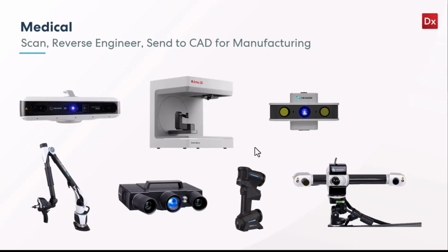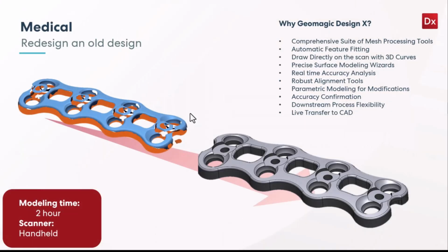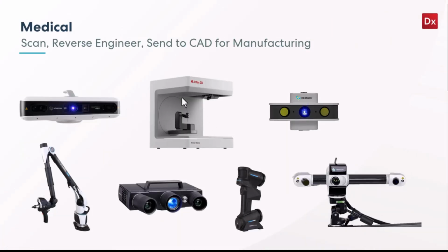So for our second one, we actually have a medical modeling example that I wanted to show. If we jump to the next slide here, with this one, I believe a white light scanner was used, and probably on a smaller scale along the lines of one of these, like this one here. A smaller sized object. And you see the scan isn't even complete, but we were able to reverse engineer the whole thing. But I believe it was a white light or blue light scanner that was used on this one.